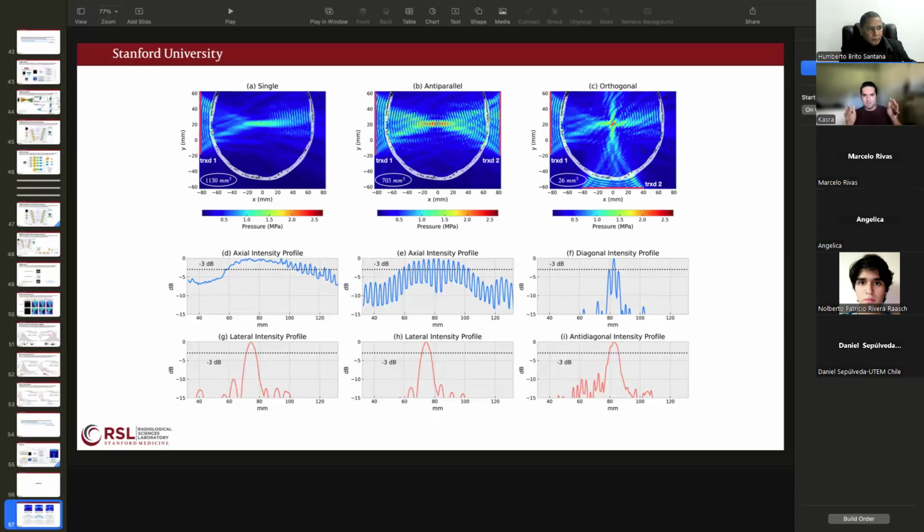Once the neurosurgeon is certain that the target is exactly where we want it to be, he asks the technician to up the intensity. Then we increase the intensity so much that we're actually cooking the brain, and there is no anesthetic, nothing. The patient is awake and aware of what's happening. The whole thing takes about 20 to 30 seconds. You cook the brain, then you pull the patient out of the MR scanner, and you give them a piece of paper with 2 dots, for example, and ask them to connect this dot to that dot. They can draw a perfectly straight line after only 20 or 30 seconds of sonication and burning that part of the brain. So that was pretty smart.